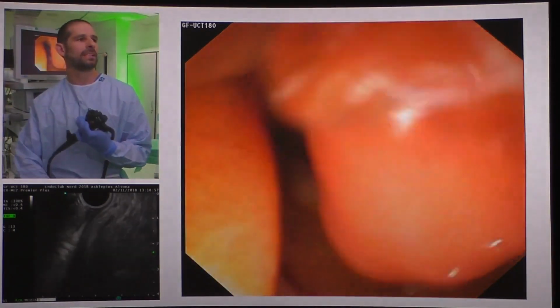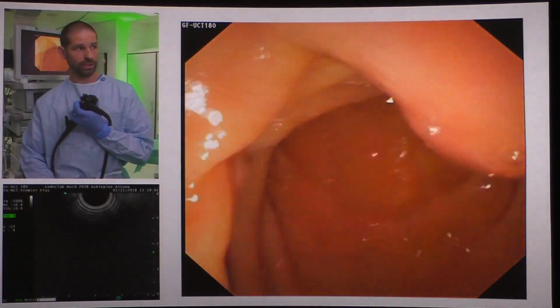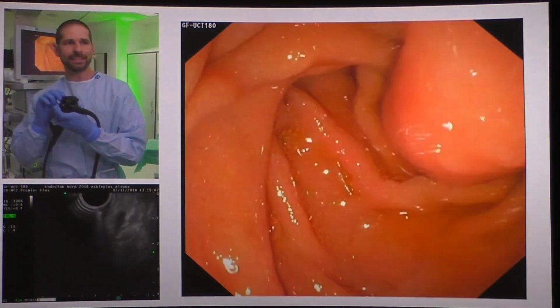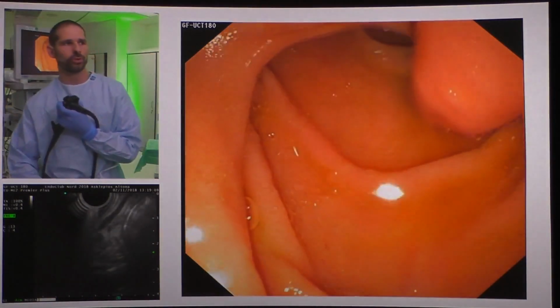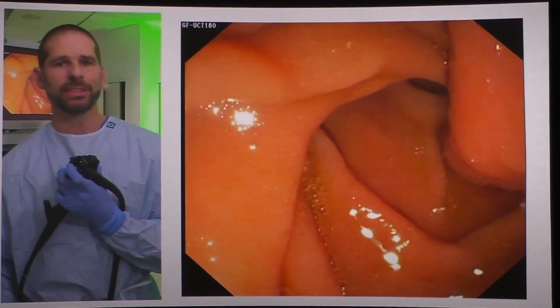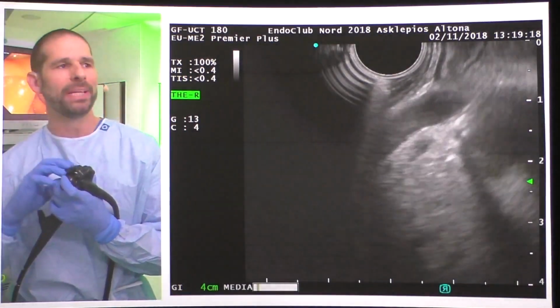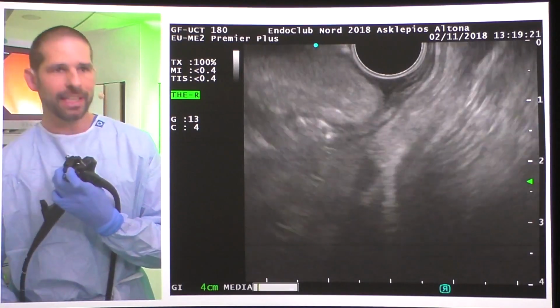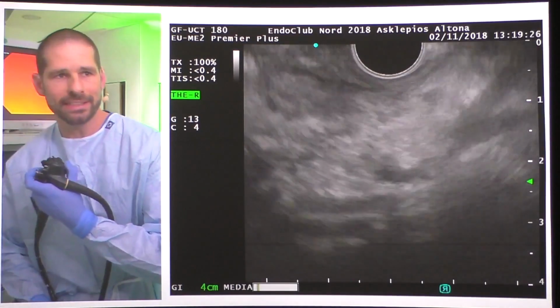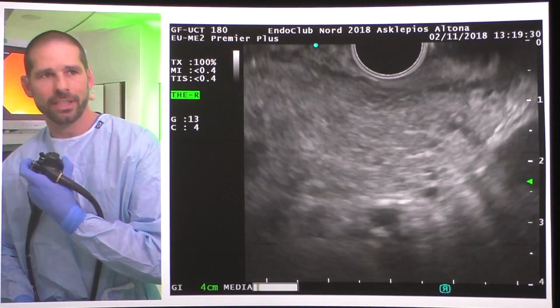So here's a long pedicle, and then at 3 it goes down, and with this pedicle it approaches the papilla and covers it so you can't really see it. Our first theory was that the submucosal tumor creates a situation where the papilla is pulled down, and this traction causes a papillary stenosis. Here you see the lipoma very nicely, but here we don't see any chronic pancreatitis.